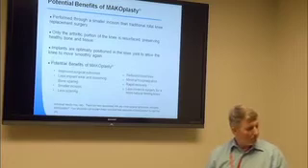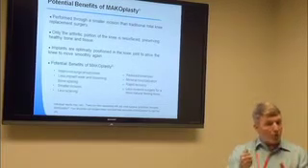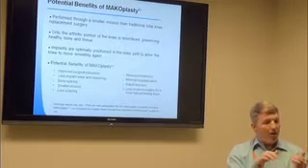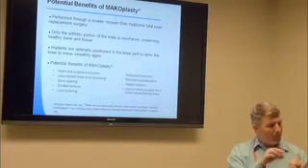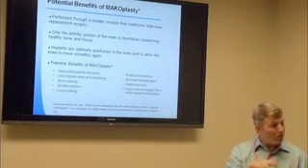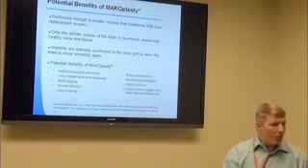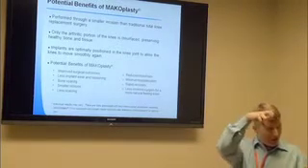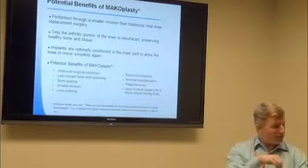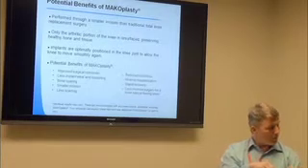How are they secured? That's a good question. Basically the bone that we burr away with the robotic arm, we replace that bone with metal and plastic. The metal adheres to the bone with a high intensity bone cement. When the pieces of metal are adhered to the bone, then we slide the piece of plastic that attaches to the bottom part of the implant.